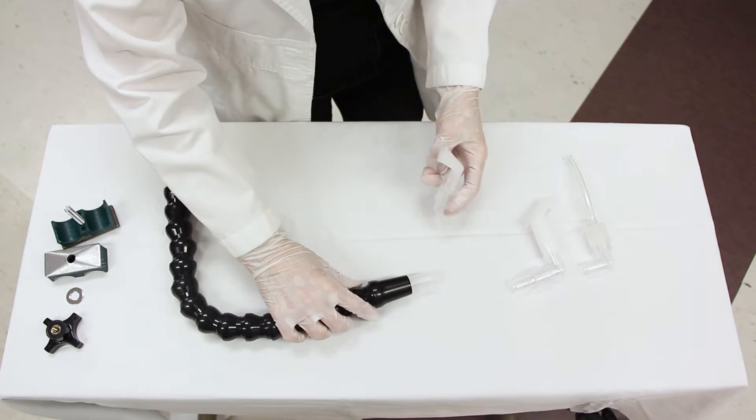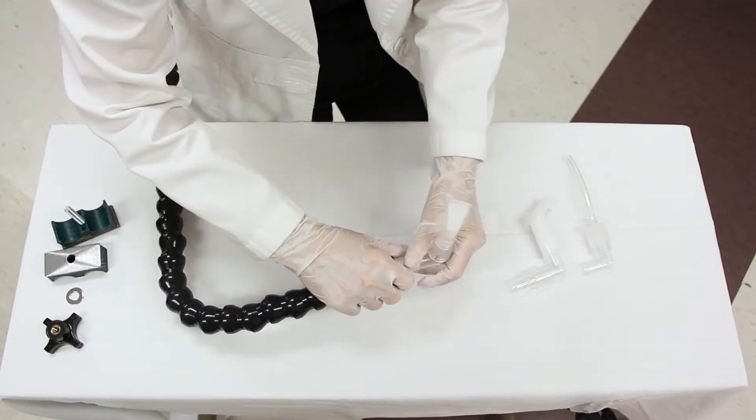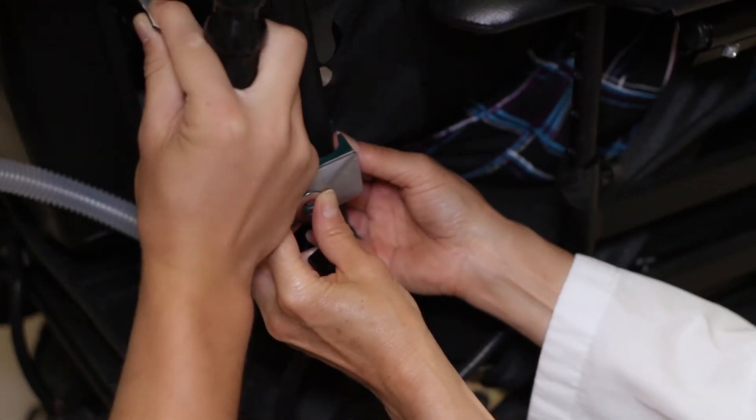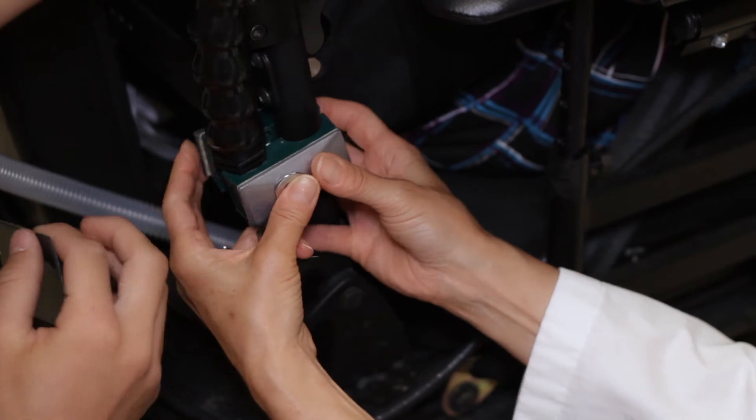Add desirable mouthpiece and angle connectors if required. Identify the most strategic place to mount the CanVent arm to the wheelchair.